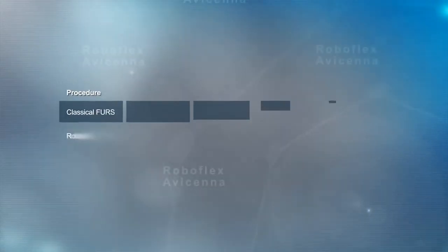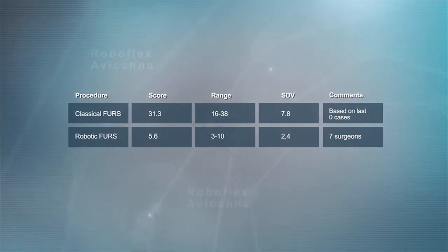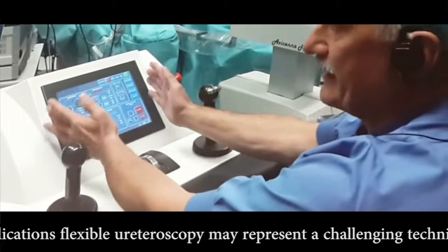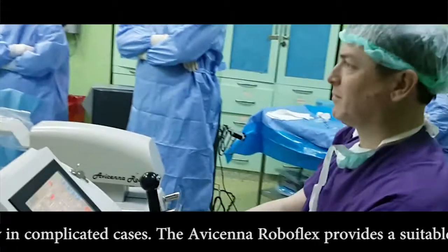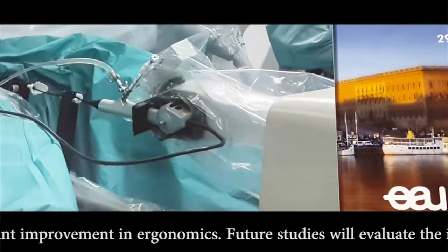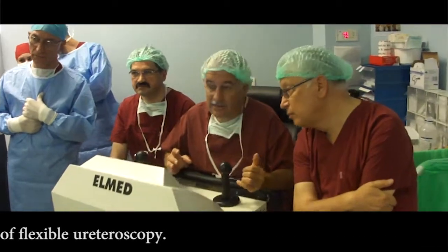Based on a validated ergonomic questionnaire, there was a significant difference when comparing the ergonomics of classical versus robot-assisted flexible ureteroscopy. With its increasing applications, flexible ureteroscopy may represent a challenging technique, particularly in complicated cases. The Avicenna Roboflex provides a suitable and safe platform for robotic flexible ureteroscopy, with significant improvement in ergonomics. Future studies will evaluate the impact of this robotic device on the clinical outcome of flexible ureteroscopy.